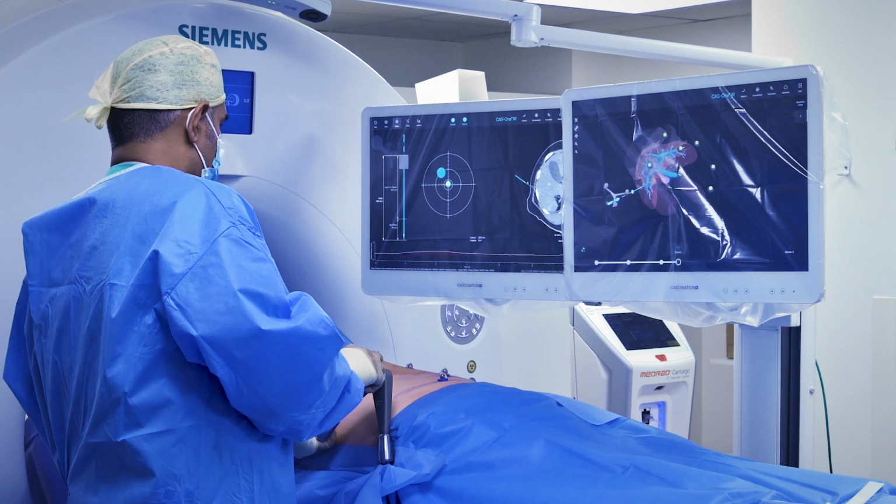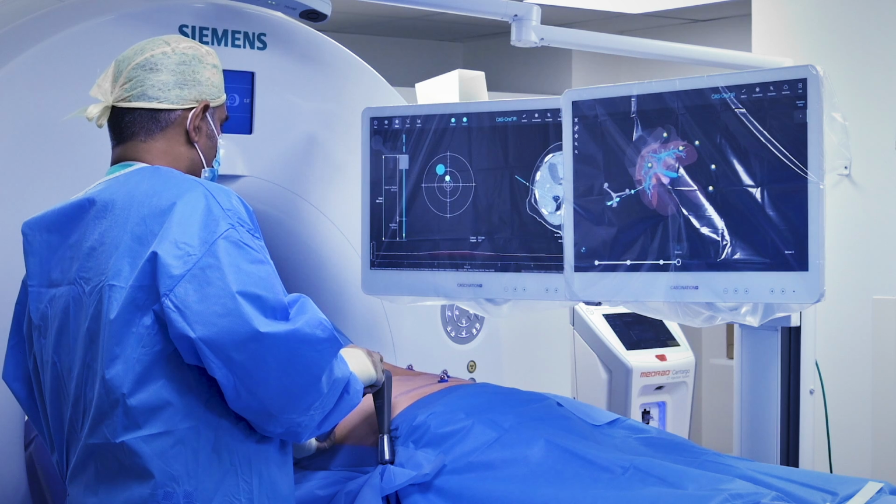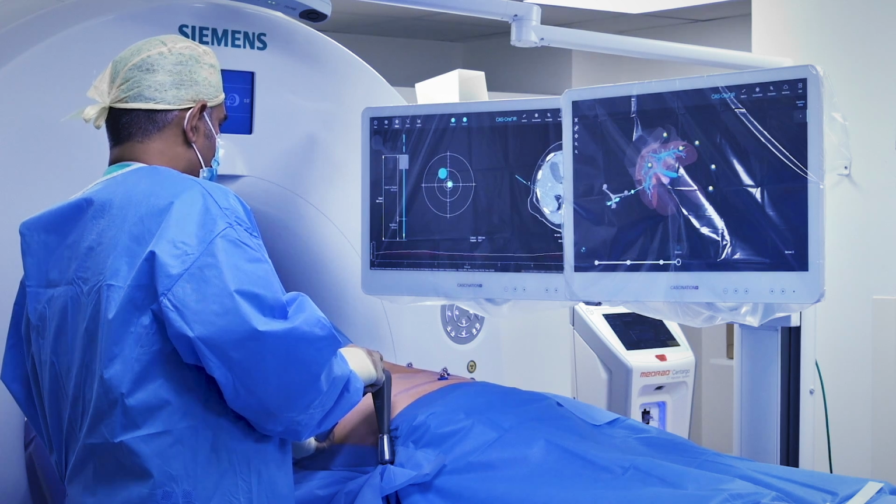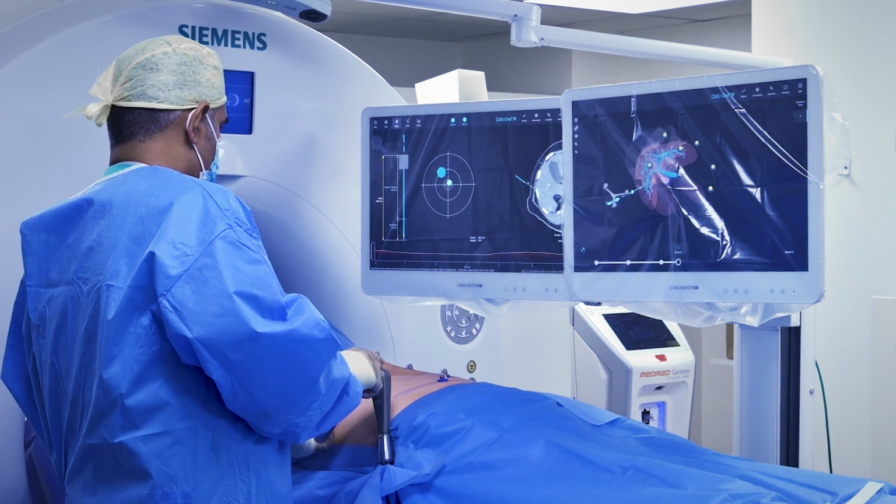I planned a trajectory here, and I'm just repositioning the needle to make sure I'm 100% happy I've got the shortest possible trajectory I can get without hitting any key structures. So I think I'm happy here.